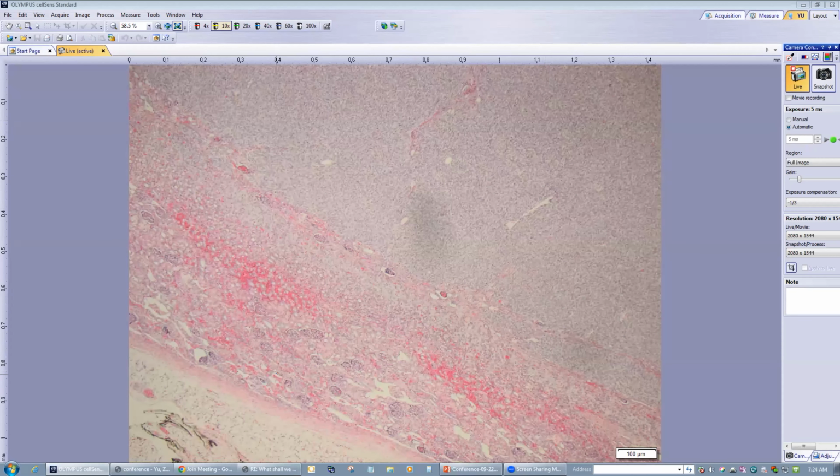This tumor is more well circumscribed, more demarcated from the normal kidney. Occasionally you can see a few normal glomeruli or normal tubules go into the tumor, but usually not going into a distance like the last case. And this tumor does not have a capsule.